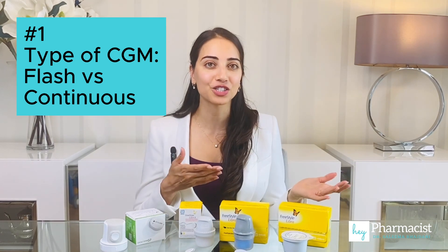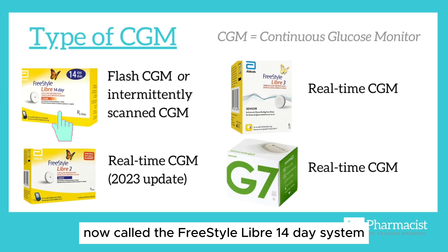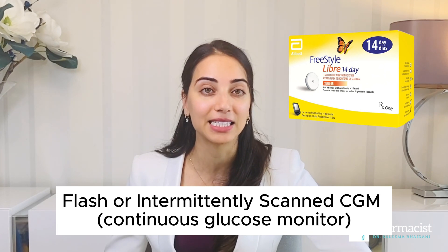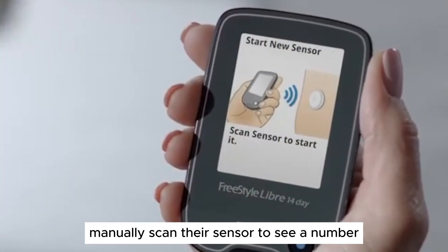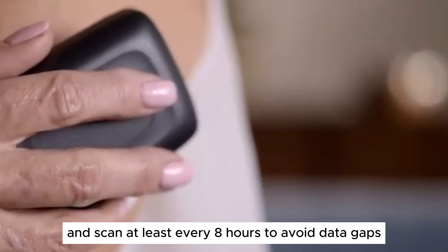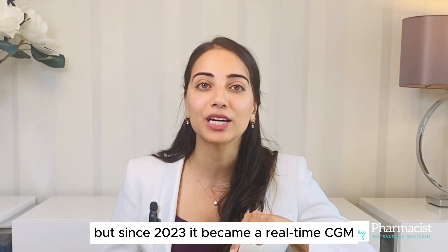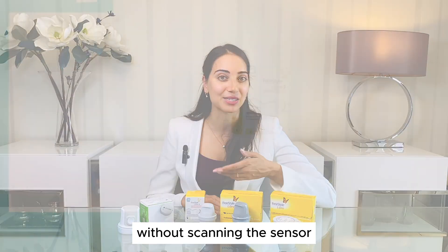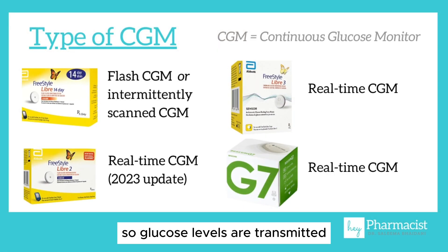First up, flash versus continuous monitoring. The Freestyle Libre 1, now called the Freestyle Libre 14-day system, is a flash glucose monitoring system, or intermittently scanned CGM. This means the individual must manually scan their sensor to see a number and scan at least every eight hours to avoid data gaps. The Libre 2 used to be like this, but since 2023 it became a real-time CGM, meaning it provides real-time glucose readings without scanning the sensor. The Freestyle Libre 3 and the Dexcom G7 are both real-time CGMs, so glucose levels are transmitted automatically to the device via Bluetooth.